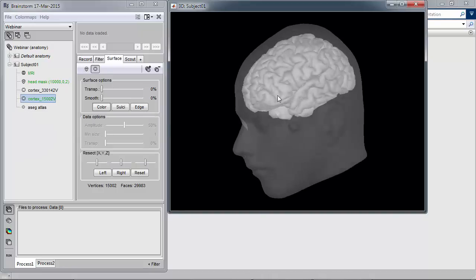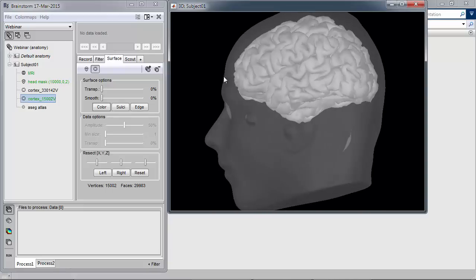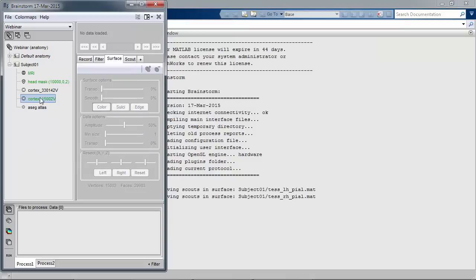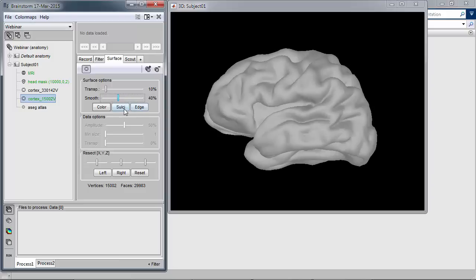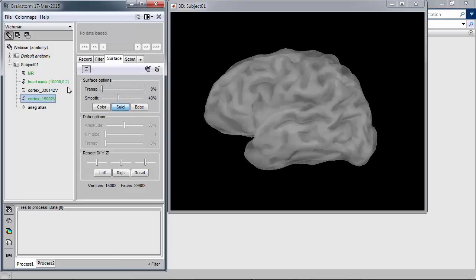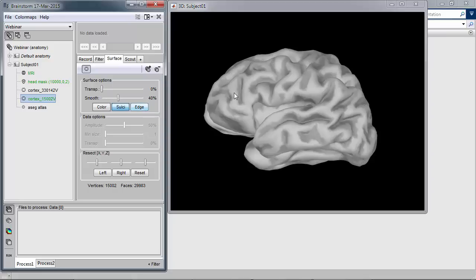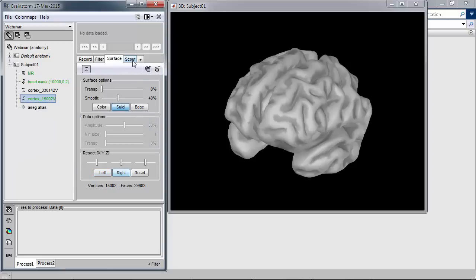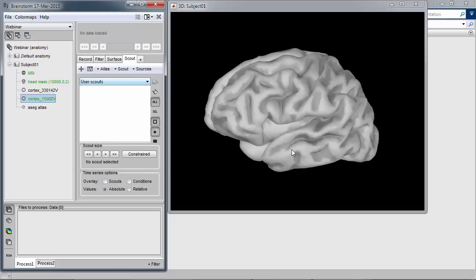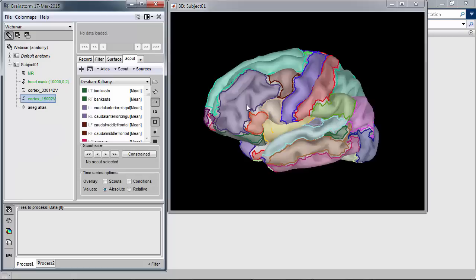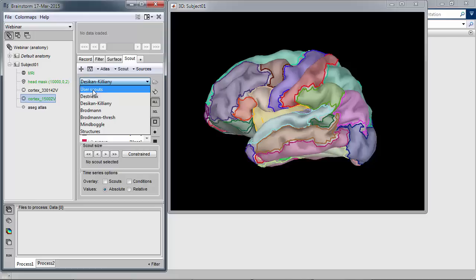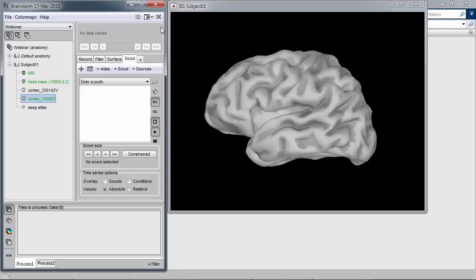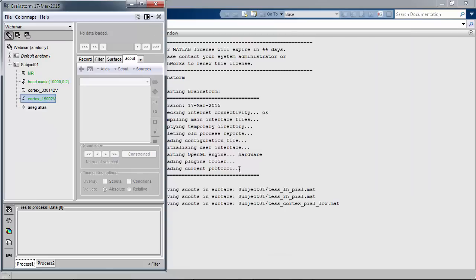Now this is done, and you see that Brainstorm is displaying the 3D rendering of the scalp surface and the cortical surface. We're going to display the cortex in a bit more detail. One of the good things is that we benefit from interacting visualization using transparency and smoothing of the surface to reveal what's inside the folds. We can also call and load directly some of the regions of interest identified automatically by the previous MRI software. If you want to clean up your desktop, you press the cross here — it empties the memory and cleans up the environment.